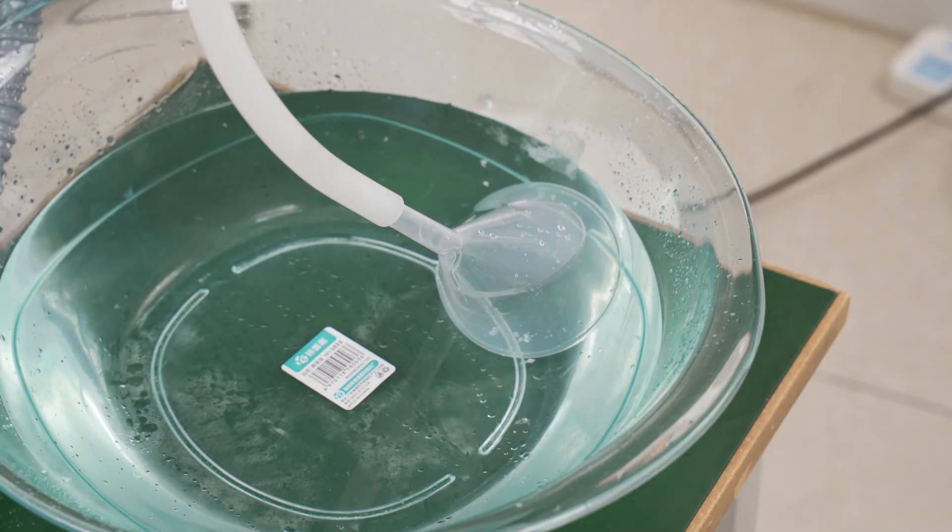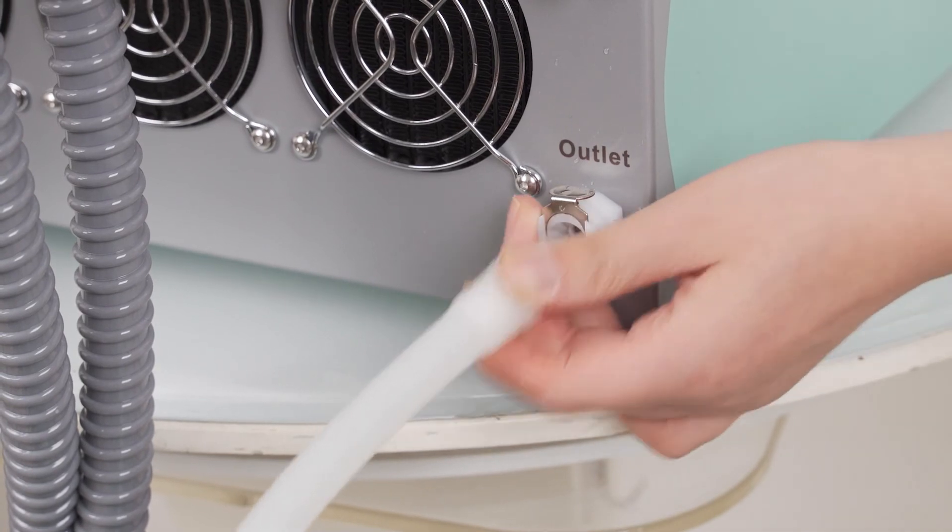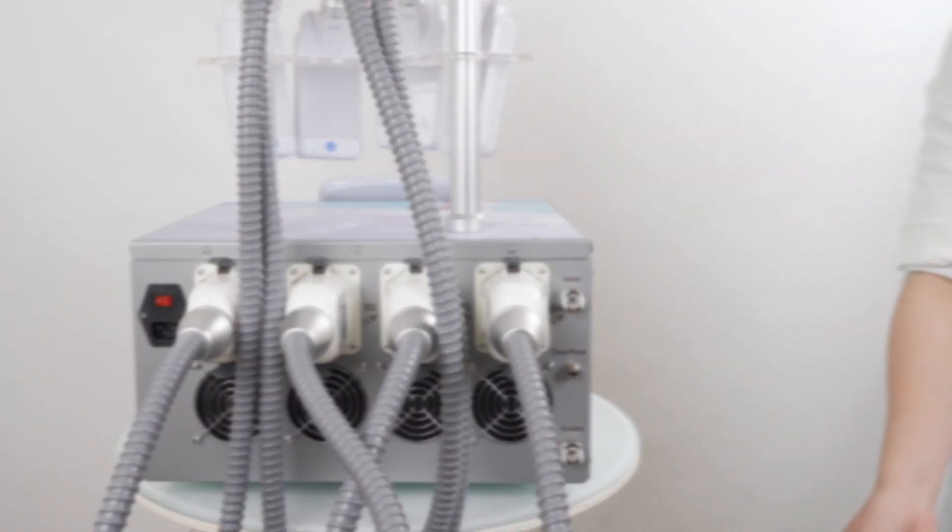When the water is emptied, press and hold the fastener at the water outlet and pull out the hose. Note: you need to empty the water out of the machine if you keep it idle for a long period of time.